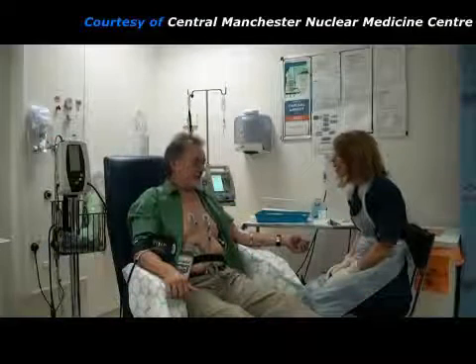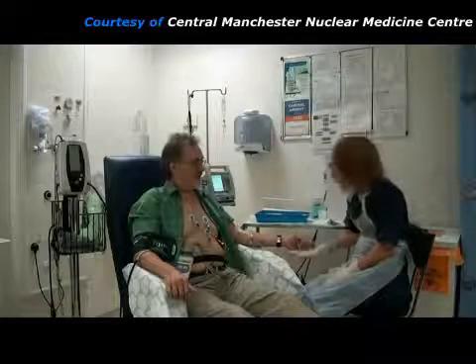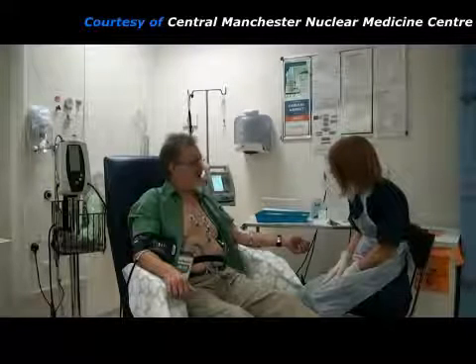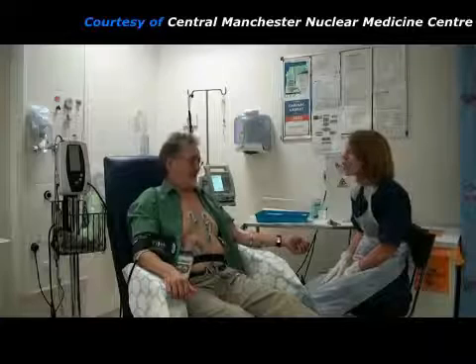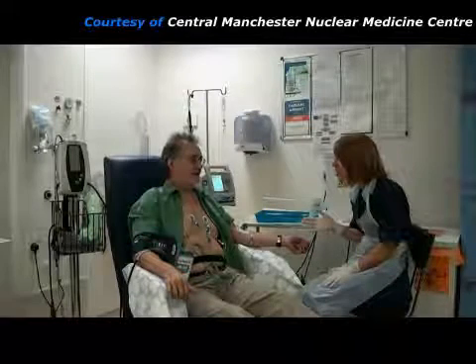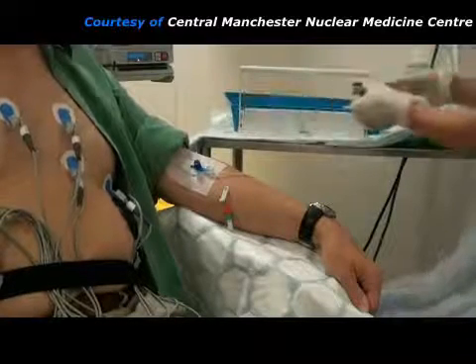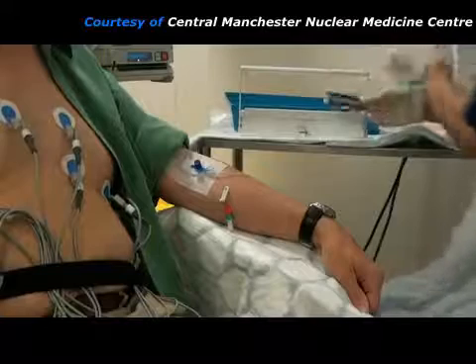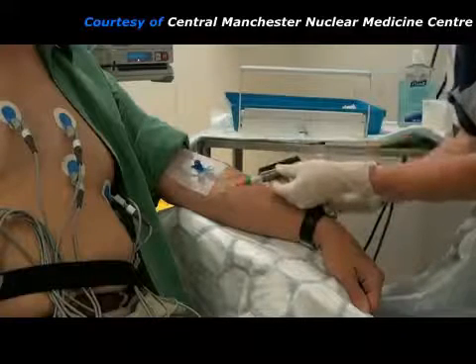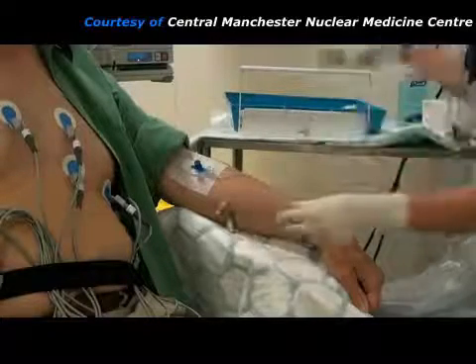Alternatively, if the patient is not able to pedal on the bicycle, they can simply sit in a chair whilst a drug is infused through the needle in their arm. This is known as pharmacological stress. Several different drugs may be used, but they all make the heartbeat faster or harder, or increase myocardial blood flow to simulate the effect of exercise. The radiopharmaceutical is kept in a lead-lined box and the syringe is shielded with lead to protect the practitioner's fingers from the radiation. When the maximum heart rate has been reached, the radiopharmaceutical is injected through the same needle, and then the stressing is continued for a further 2 minutes.